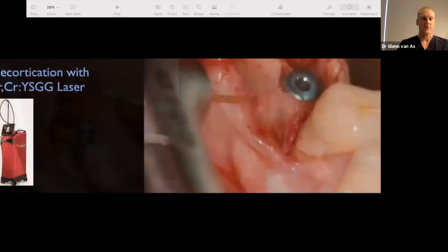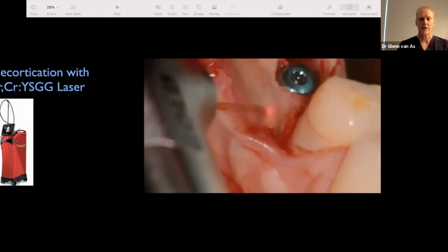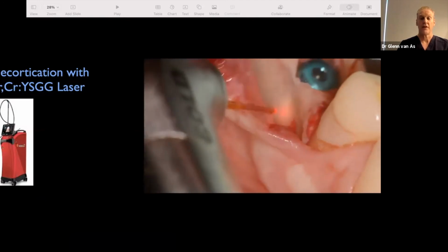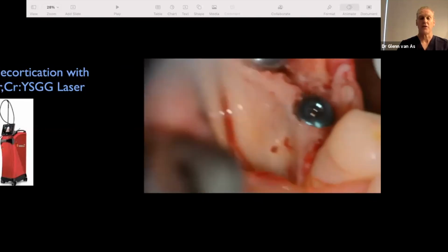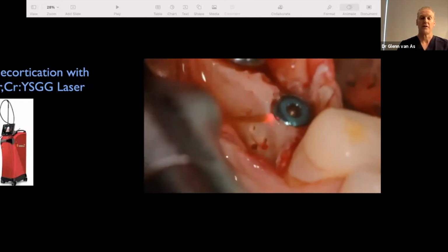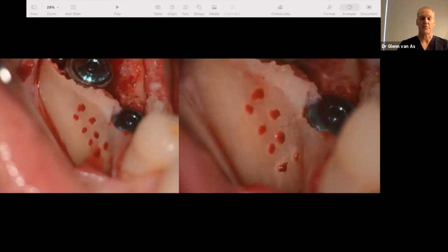So what we're going to do is we're going to actually use the erbium laser, and we're going to decorticate. And you'll see how quickly this is. I'm not worried about the burr touching the implant or causing any heat on the implant, because there's water coming off the laser. And we just make little 1mm spots in the cortical bone into the medullary space, and you get a release of your PDGF. And you'll see afterwards, after I use this, I can very quickly put 8 to 10 little precise spots here. And immediately afterwards, you can see here these precise spots that we've put in so that we have the release of the PDGF and our growth factors.